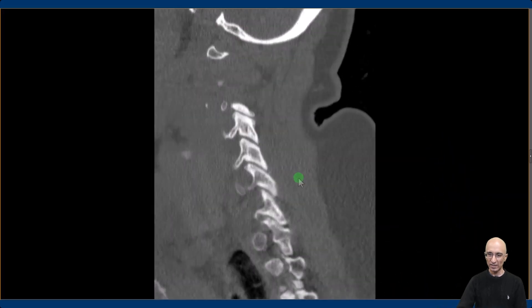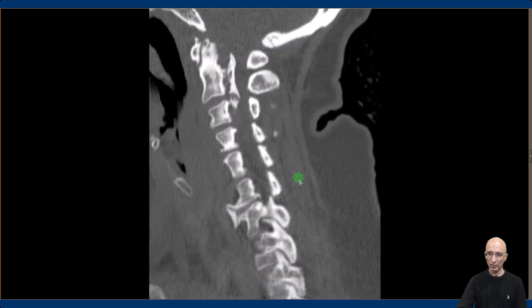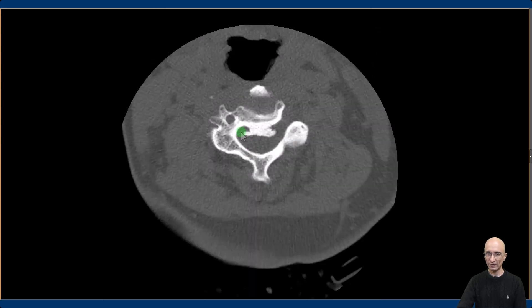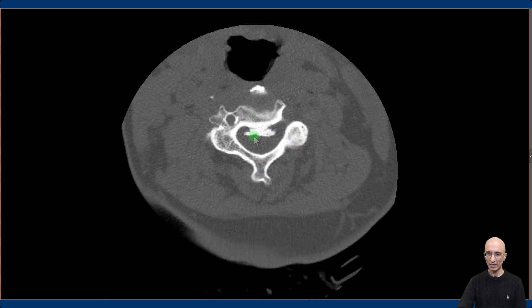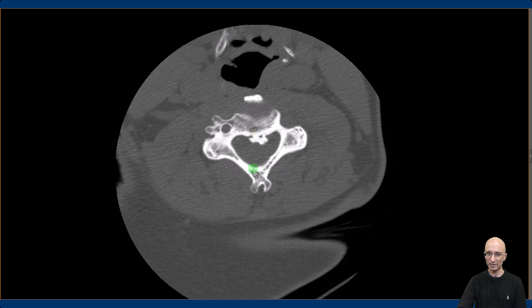On the sagittal cervical spine images there was no evidence of acute fracture or traumatic listhesis. The patient has extensive ossification of the posterior longitudinal ligament, most prominent at C2-C3 level and at C5-C6 level, causing severe narrowing of the spinal canal. On the axial images, we can again identify marked ossification of the posterior longitudinal ligament narrowing the spinal canal at multiple levels.